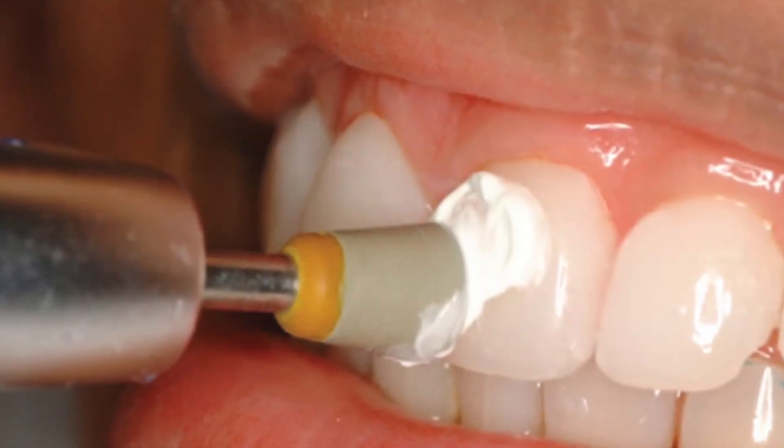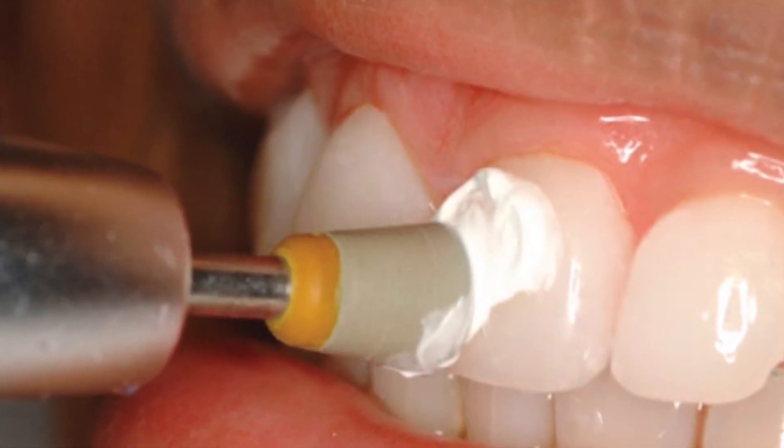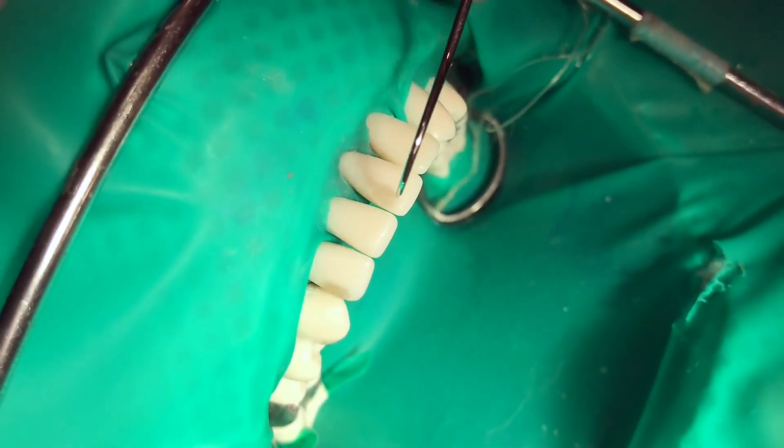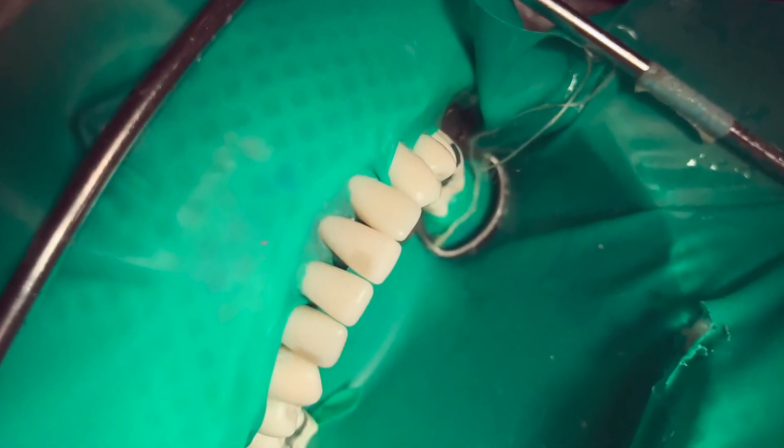After finishing, polish the composite with rubber cups and polishing paste. If your composite is already smooth, you can skip this step. Use an explorer to make sure that there are no open margins or excess at the interface of the composite and the tooth.